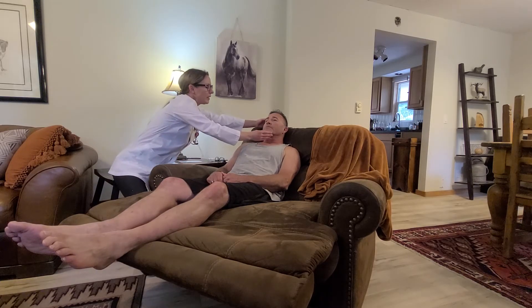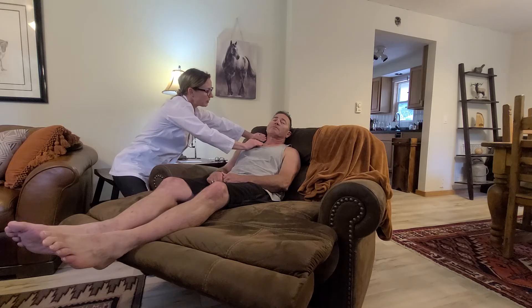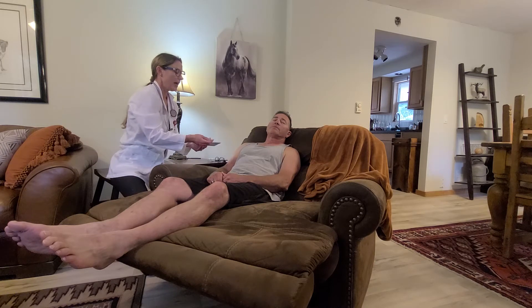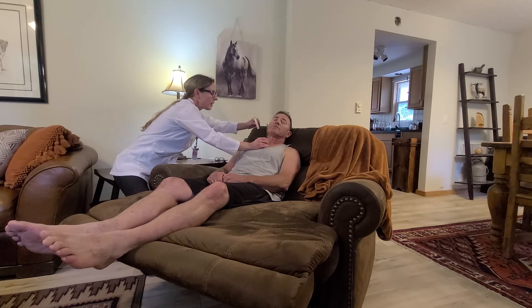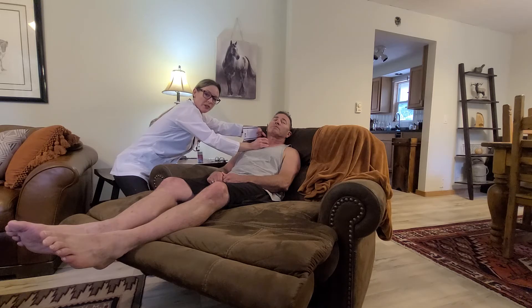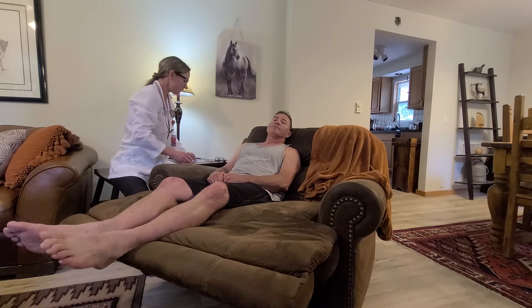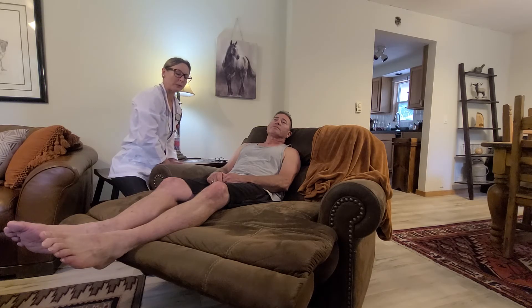I'm going to place him at a 30 to 45 degree angle and have him turn his head a little bit to the left. I'm noticing the jugular vein pulsation here. I'm going to measure the jugular venous pressure by placing my ruler on the sternal angle and looking for the point of highest oscillation of the jugular venous pulse. His jugular venous pressure is one centimeter with the head of the bed at 30 degrees. This is normal, as jugular venous pressure should be less than three centimeters.